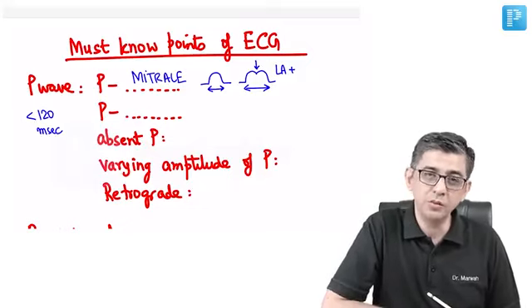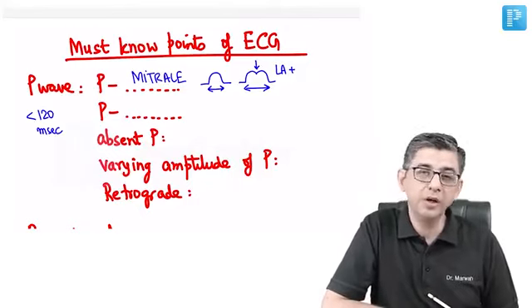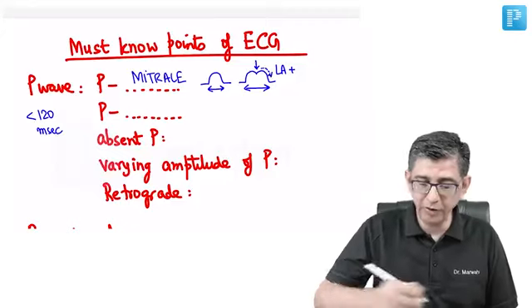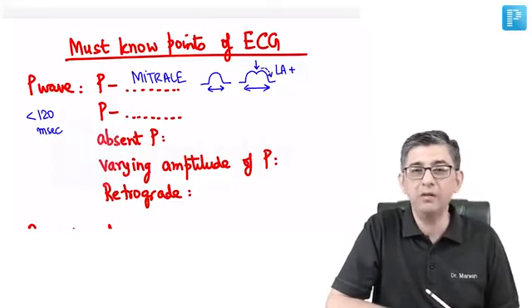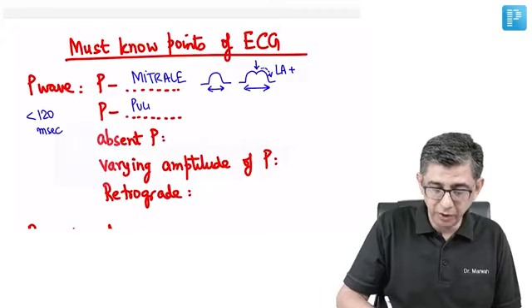You see, in mitral stenosis, because the orifice is narrow, the left atria will dilate, and therefore the current will take more time to go across this dilated left atria, which results in P mitral to develop. In the same patient, subsequently, there might even be a development of pulmonary artery hypertension, when the finding that would be encountered would be called P pulmonale.